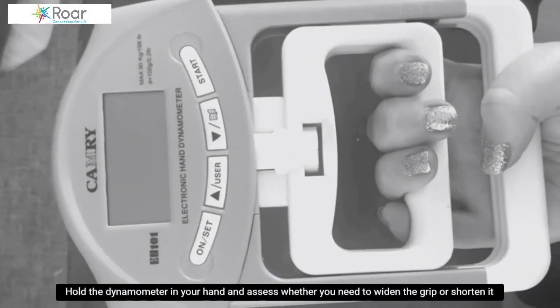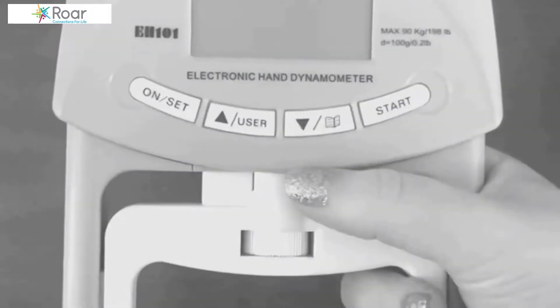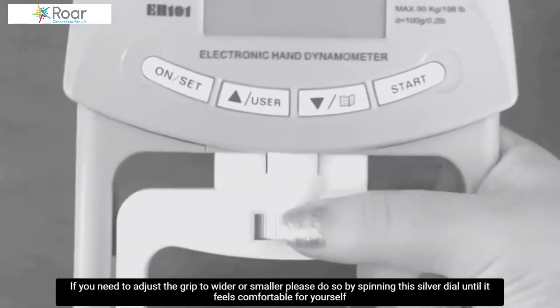Hold the dynamometer in your hands and assess whether you need to widen the grip or shorten it. If you need to adjust the grip to wider or smaller, please do so by spinning this silver dial until it feels comfortable for yourself.